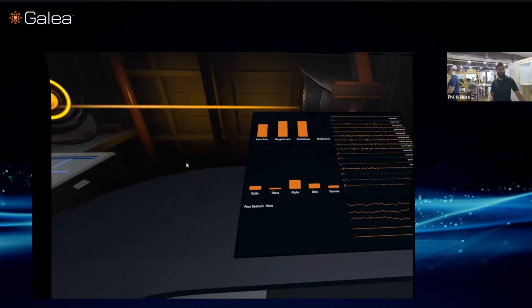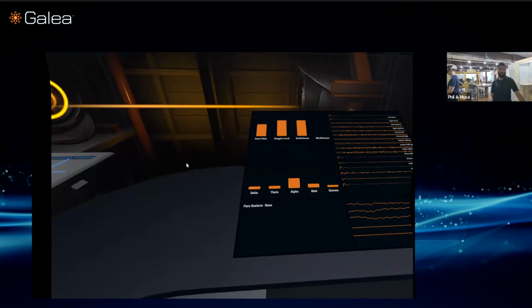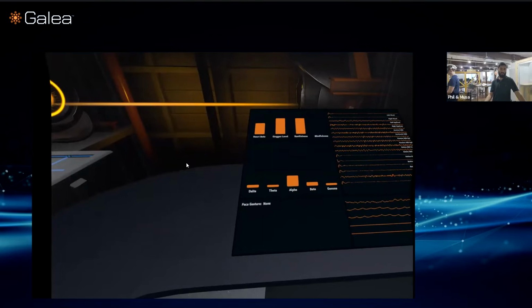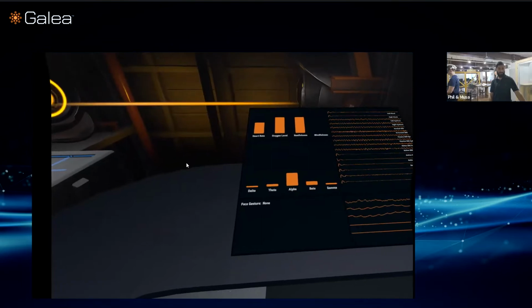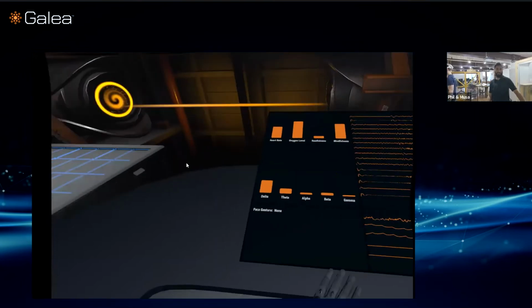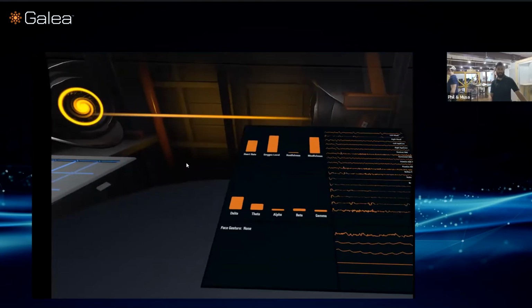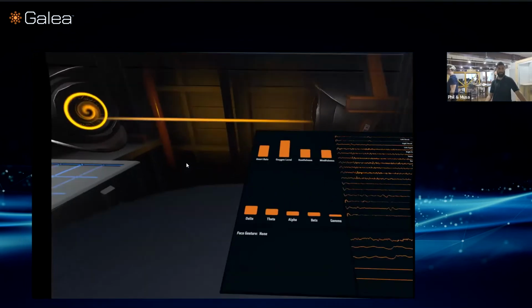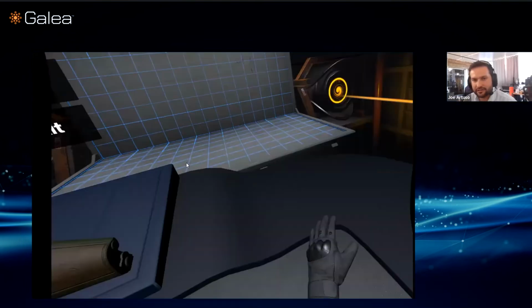This sort of information can be used to eke out useful metrics, such as, like we mentioned in the past, cognitive load and stress. We're going to use a sensor fusion approach where we're using heart rate, oxygen level, EEG, EMG, all of these components, and that should give us a better idea of what's going on with the user.